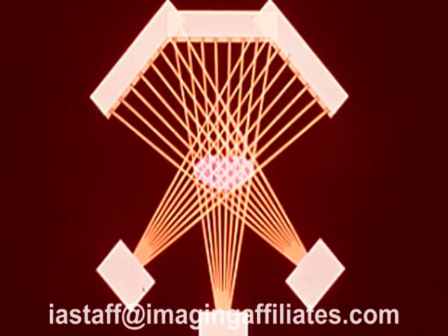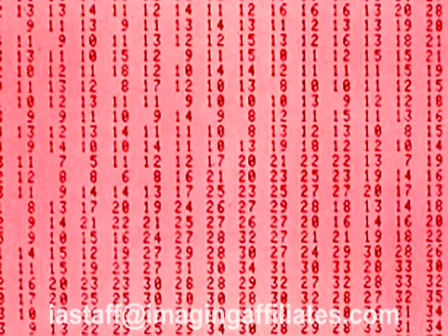The way in which multiple views of the patient from different angles are generated has been approached several different ways. All, however, involve moving the X-ray source about the patient. Following reconstruction, the patient slice is represented by a series of numbers, each one representing the tissue attenuation coefficient for a small volume of patient. In this slide of the CT numbers representing an axial slice through the head, the position of the skull can be seen because of the higher numbers associated with the relatively dense bone.